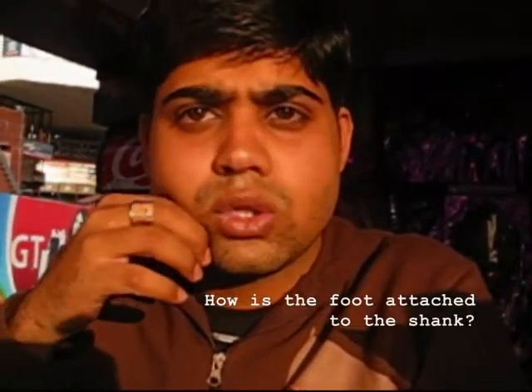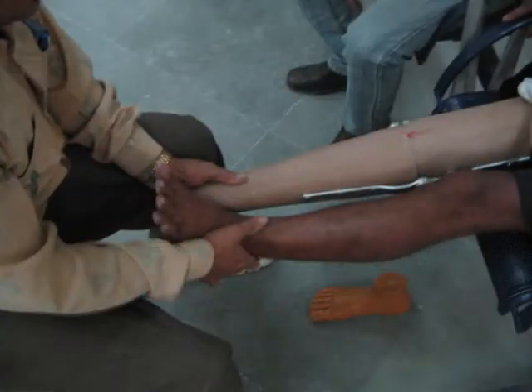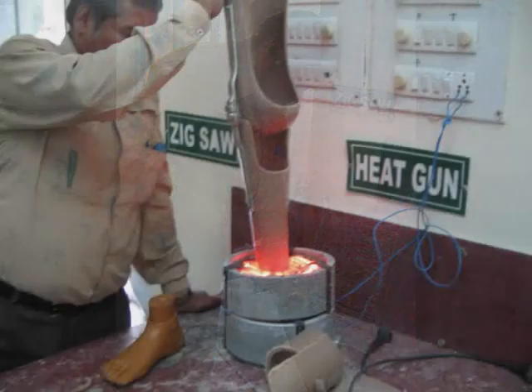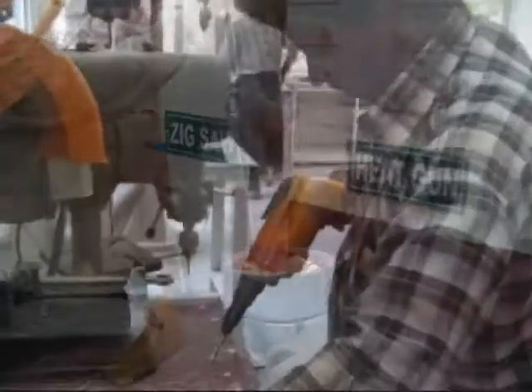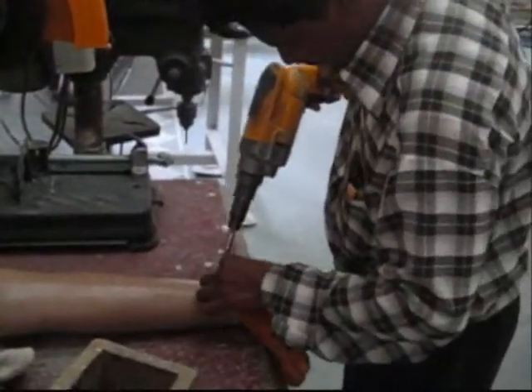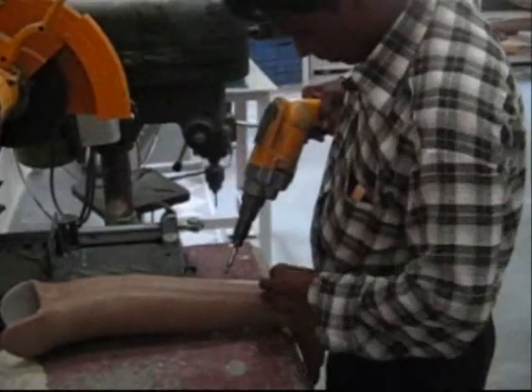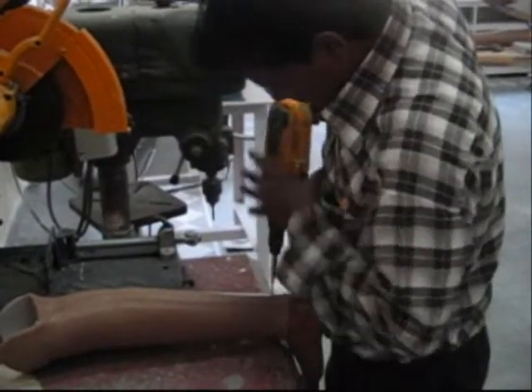How is the foot attached to the shank? During the assembly, the foot is inserted into the bottom of the shank after it has been heated, and it's fixed with 4 tapped screws. Even though it's simple and fast, the screws damage both shank and foot after a few months of intense use.